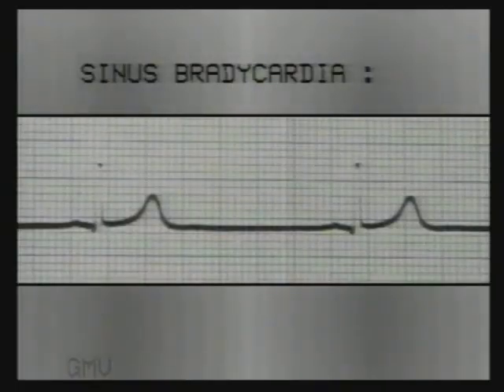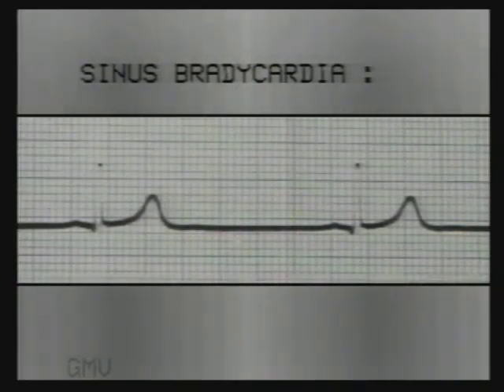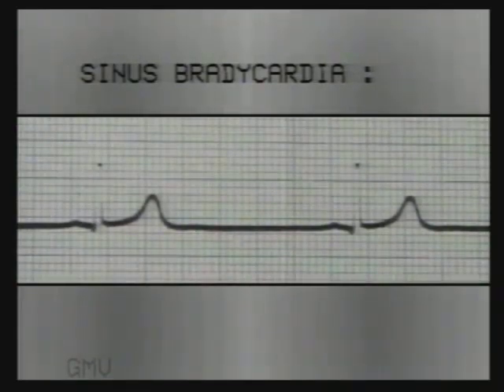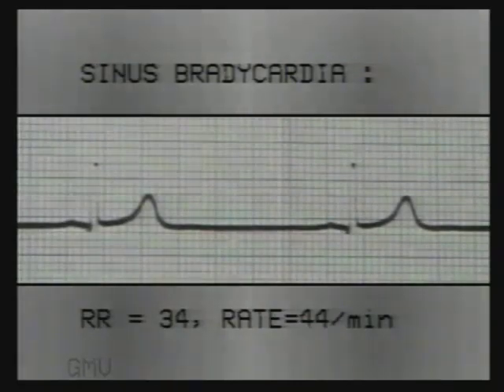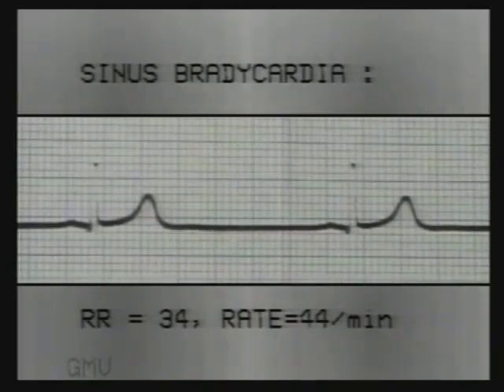In such a case, if the heart rate is below 60 per minute — that is, the RR interval is more than 25 small squares — it is termed as sinus bradycardia. In this ECG, the RR interval is 34 millimetres, so the heart rate is 44 per minute. P wave, PR interval and QRS are normal, indicating sinus rhythm.